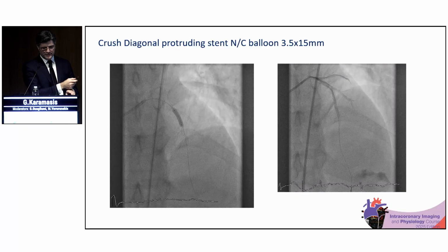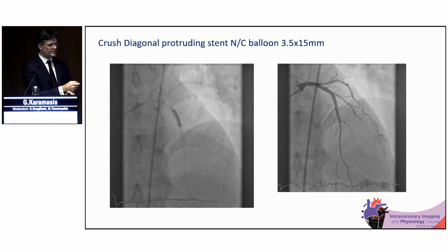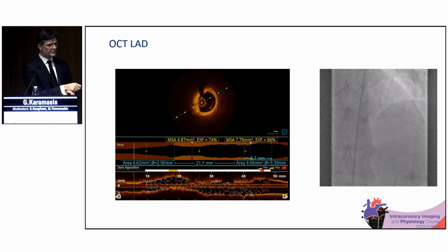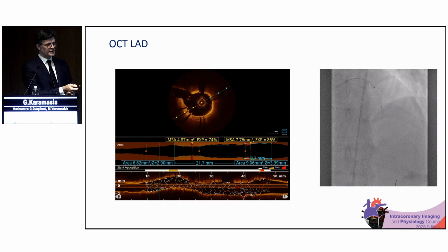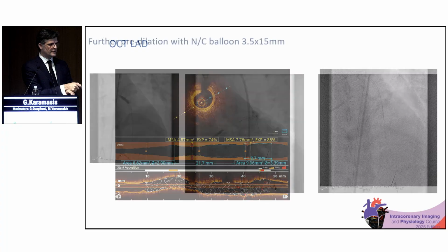So we can go back maybe to the presentation, and now we have this situation. This proximal LAD stent is actually destroyed. And okay, we saw that. I just let it play to show how easily the OCT now goes down because we have the distortion that we saw earlier.